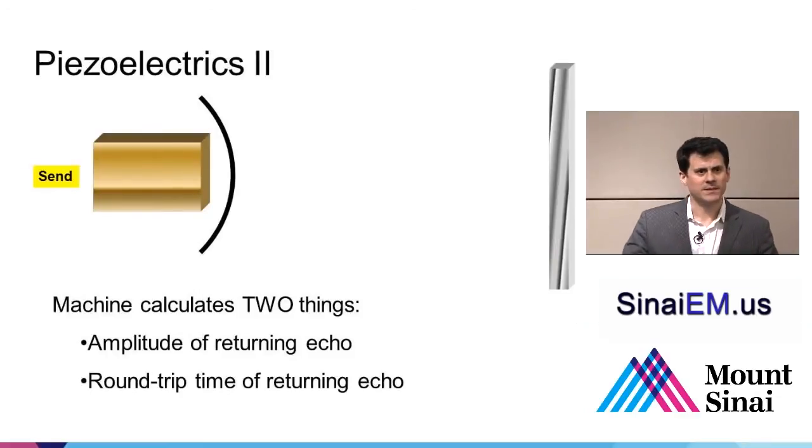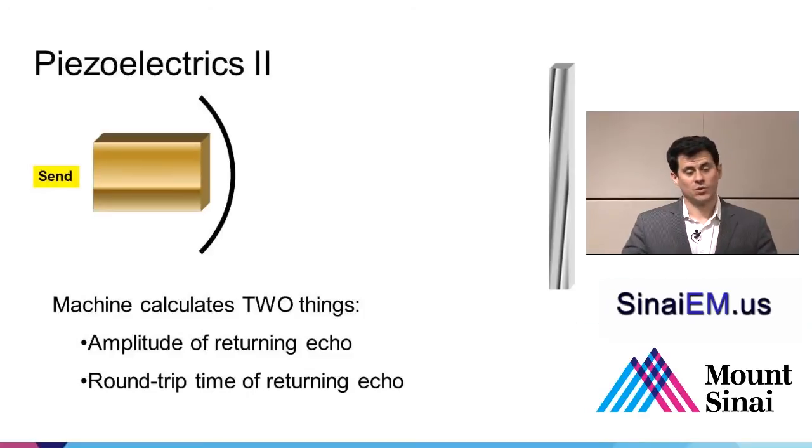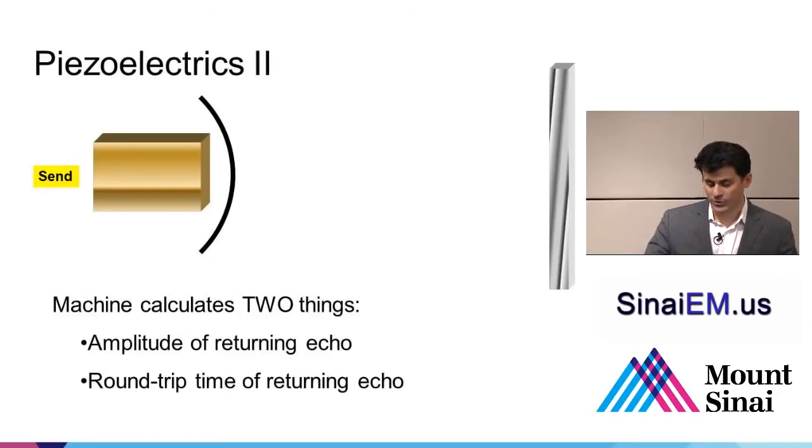So how exactly does the image get formed? We have this piezoelectric crystal, and we're intermittently sending pulses of electricity through it to create sound waves. Those sound waves then propagate into the tissue, and they're going to get reflected back. A lot of things happen inside the tissue. Some of the sound waves get reflected, some of them get refracted off in different directions, some of it gets absorbed as heat energy because it is, after all, moving molecules, which is by definition kinetic energy. But the image itself is formed by the beams that are reflected off tissues back to the origin.